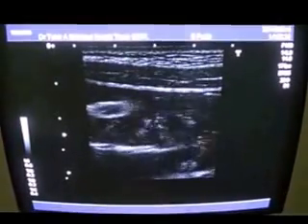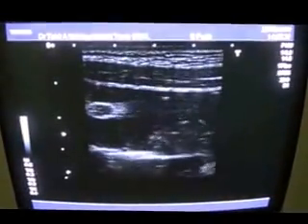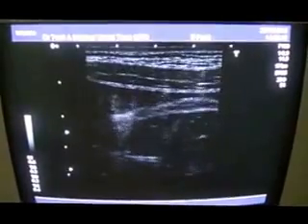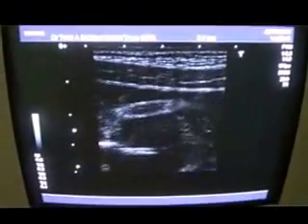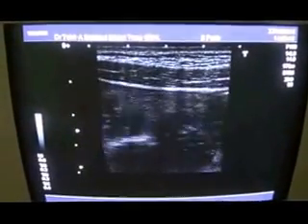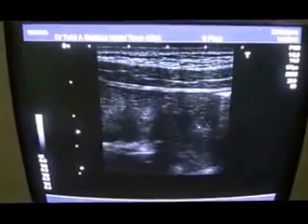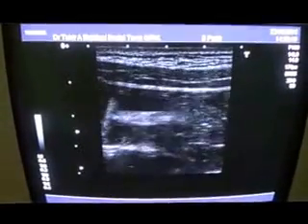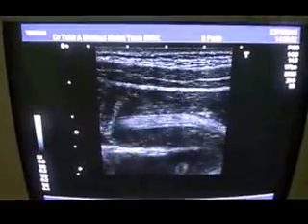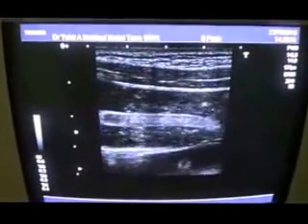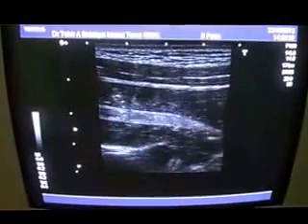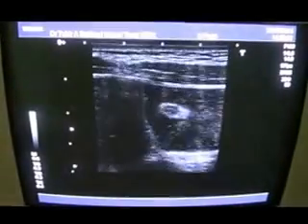This is an ultrasound with a 7.5 MHz linear transducer of a child. What we are seeing are the bowel segments, and within this bowel segment you are seeing a linear echogenic structure. This extends from the supra-pubic region.